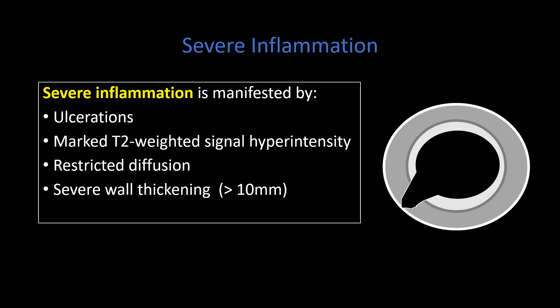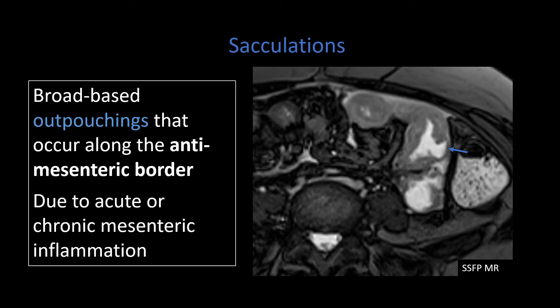Severe inflammation features include ulcerations, marked T2 weighted signal hyperintensity, diffusion restriction, and severe bowel wall thickening. Sacculations may be related to acute or chronic inflammation — similar to ulcerations, they tend to occur along the anti-mesenteric border and are another manifestation of severe or progressive Crohn's disease, potentially an early manifestation of penetrating disease, although that is not well understood.